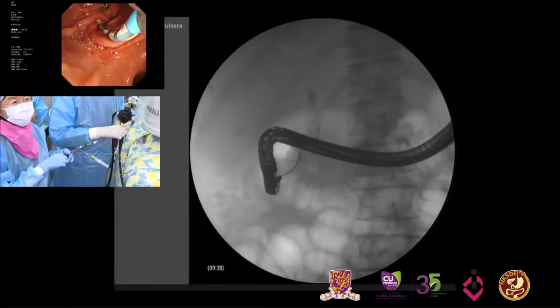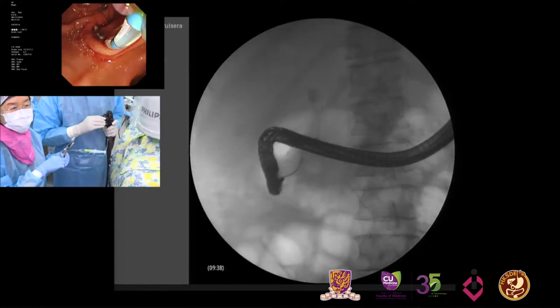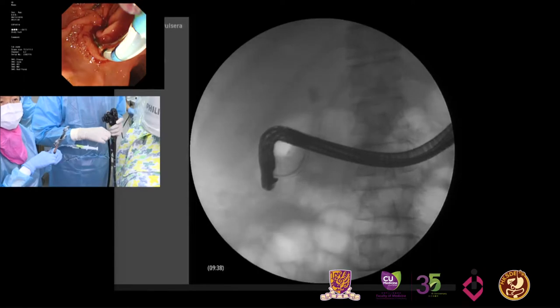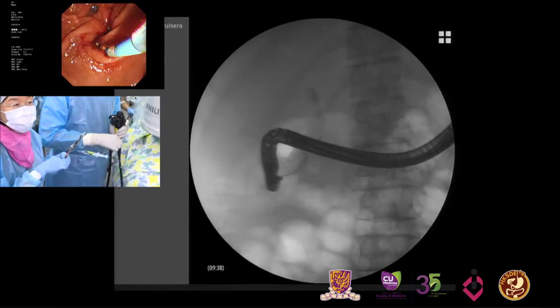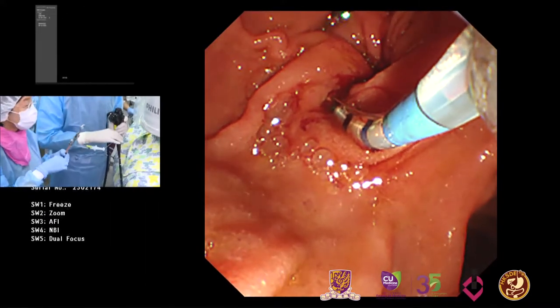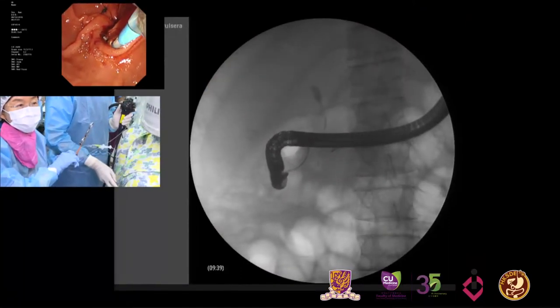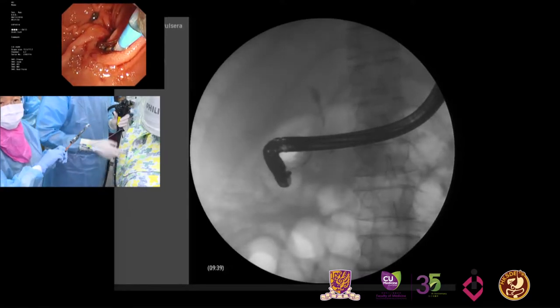So then what I'm going to do now is change my scope position a little so that the wire goes in. What I have to do is actually straighten the scope. So you see, now the angle is more, so that's why the wire is not going in. I'm straightening the scope a little. Now can you see if you can pass the wire? I'll just push the scope up like this so you can see better. So you'll have to go down and then go up.